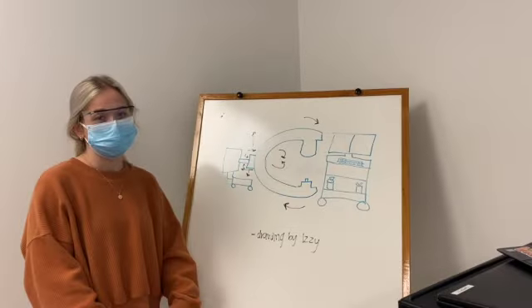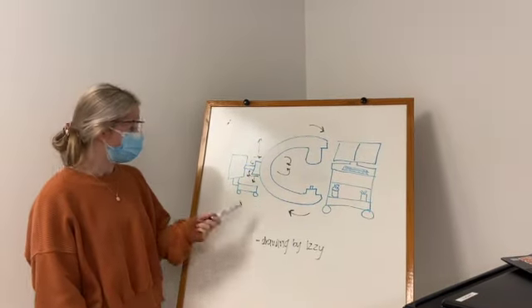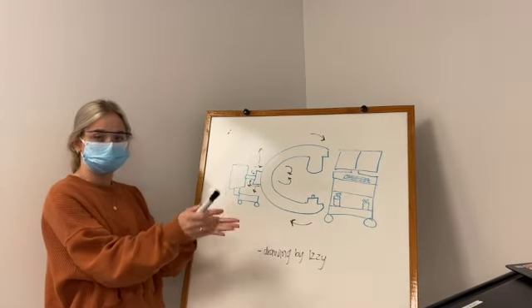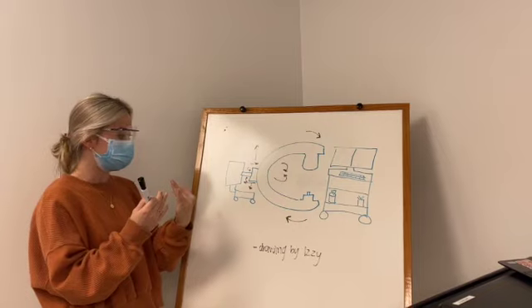This is a basic configuration of a C-arm. So some of the things that you can do, you can drive the C-arm in and out, so towards the operating table and away from the operating table.